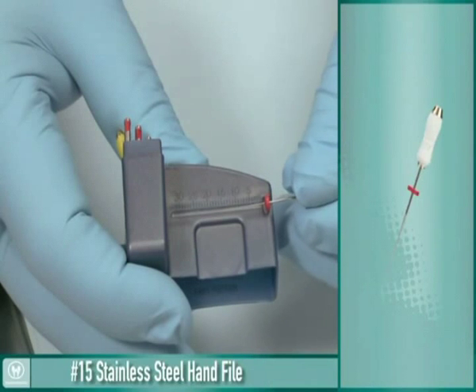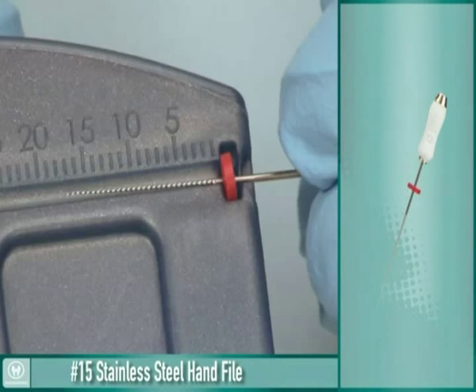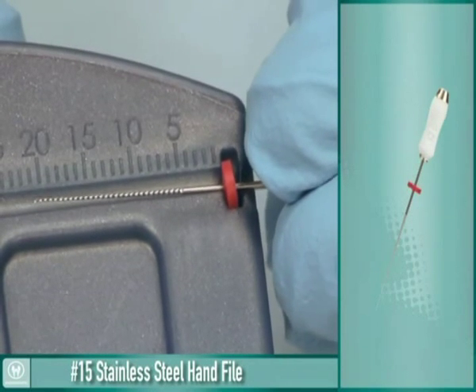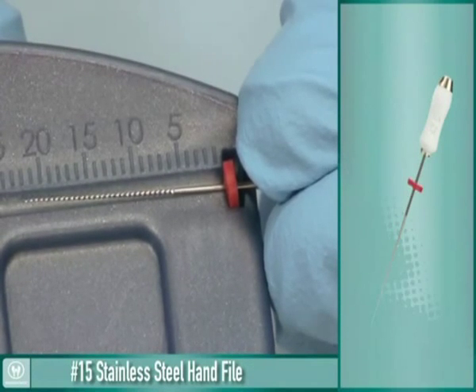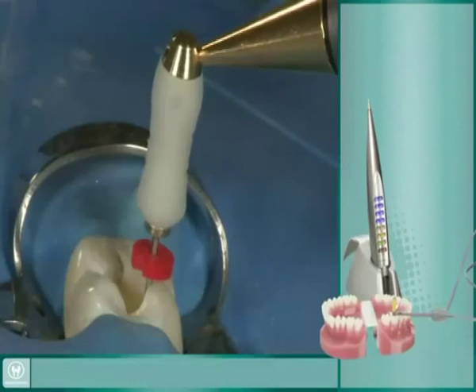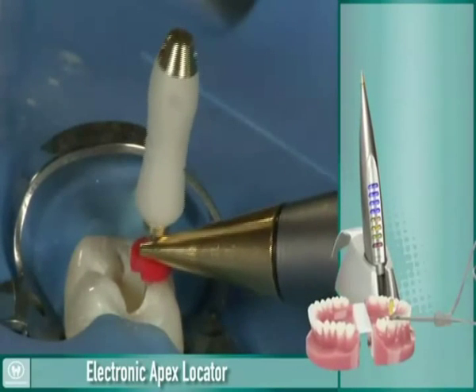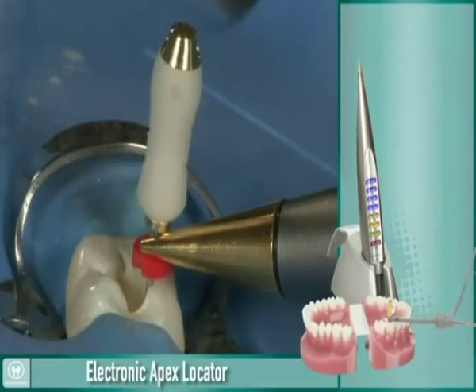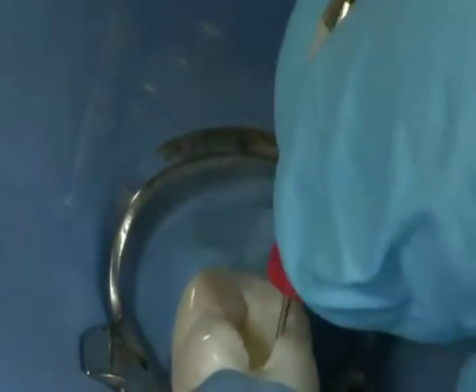Using the number 15 stainless steel hand file, establish intercanal patency by taking the file to about one-half to one millimeter short of the canal length, or where the canal apical constriction is located. At this point, the use of an electronic apex locator will give another point to help determine a precise working length for the canal. After locating the apical foramen and finalizing the working length, use a gentle watch winding motion to work the number 15 hand file until it is loose.